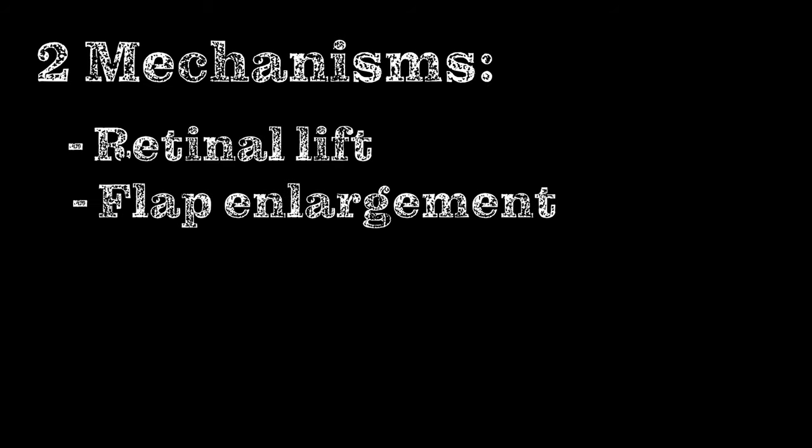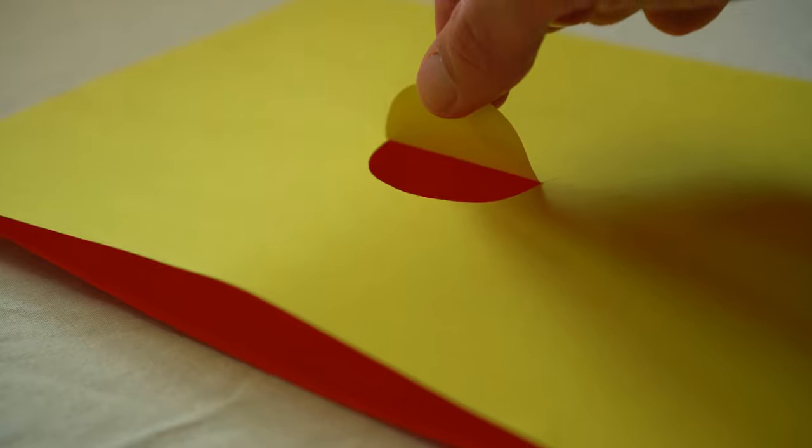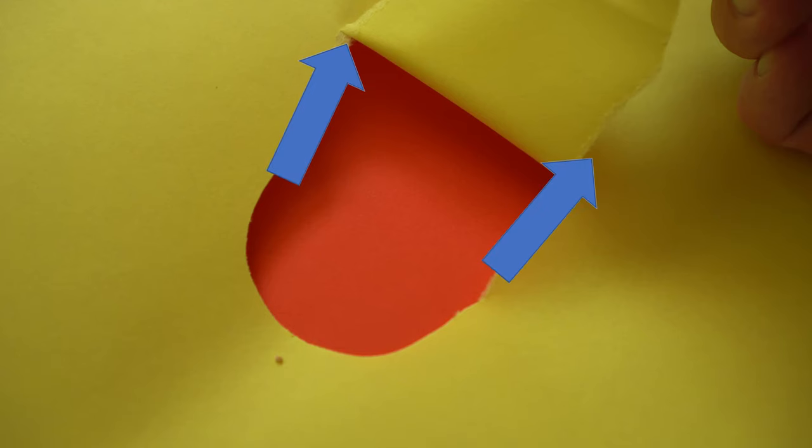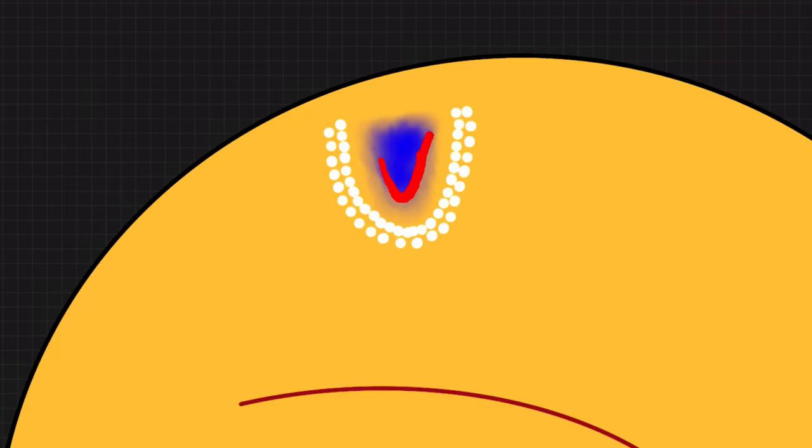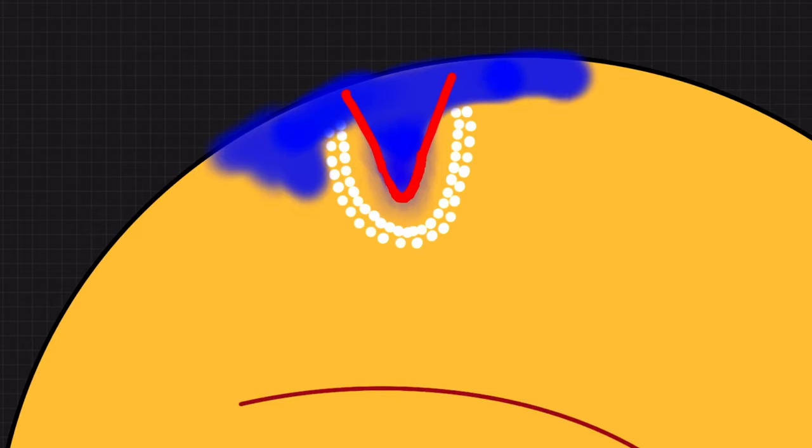But as we've learned before, there are two mechanisms that turn a retinal tear into detachment. We have now prevented the water from flowing underneath, but we still need to take care of those tear lines. If you don't put any laser spots anterior to the tear, the tear can enlarge and the retina can detach from behind your laser row.